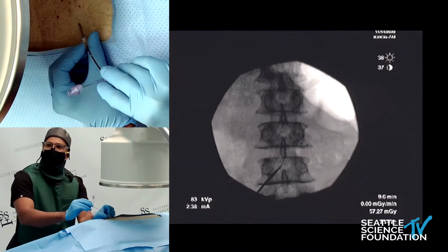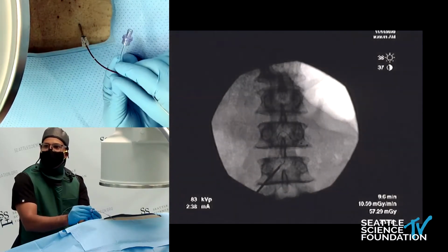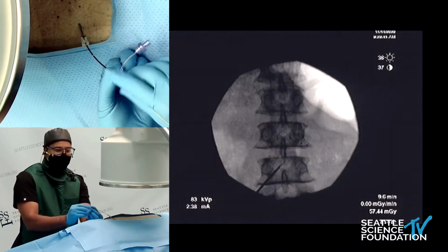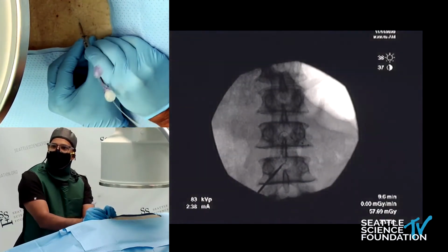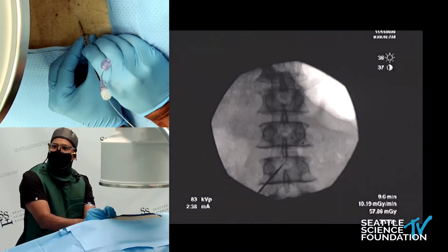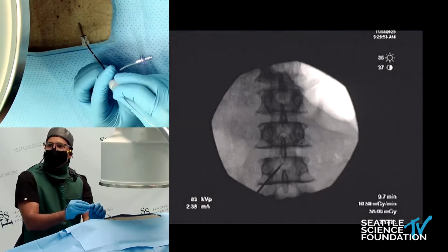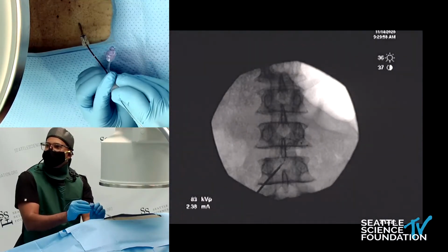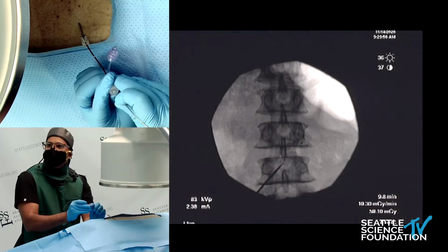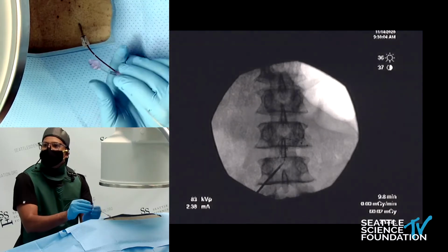You can see I've made that cephalad loop, and now what I'm going to do is I'm going to turn my whole apparatus to the right. And what I'm going to try to do here is create a caudal loop. And I'm going to do that just by pushing some lead in. So it wants to do the funky loop here. And that's okay, because there's just some stuff we have to contend with.